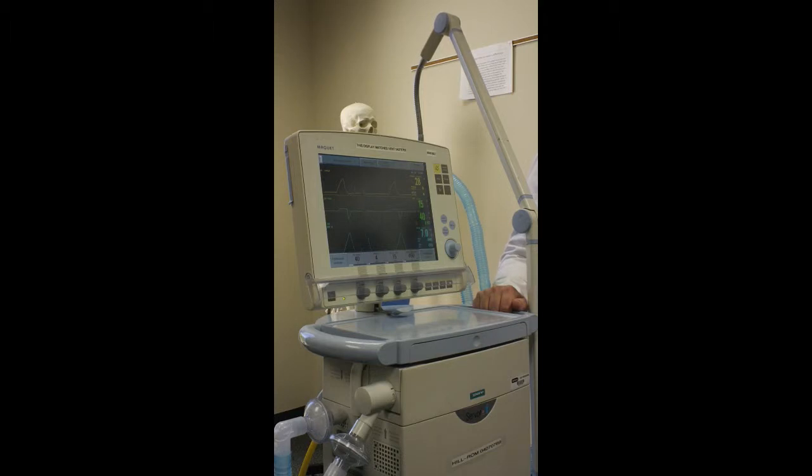Even when you're charting in a computer, I know they don't do it in the computer charting, so I don't know if it's possible. On computers it would be different, but paper charting, you definitely need to. A lot of them, depending on what you set it, will already have the parameters for it. Sometimes they'll even be shaded out and you know that that's not a possibility. And you'll also learn, oh, I'm in pressure control, I don't need to look for a tidal, I'm not gonna have a set tidal volume.